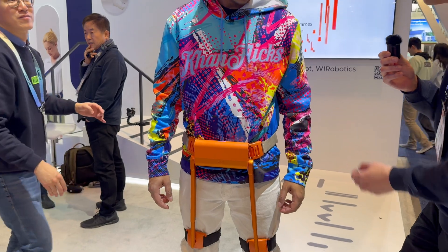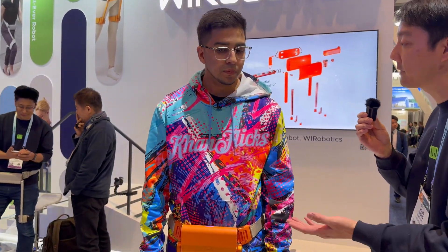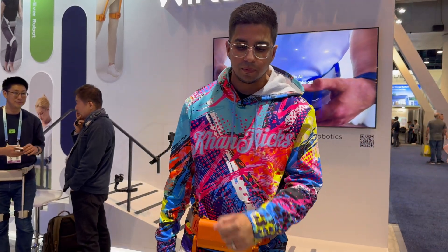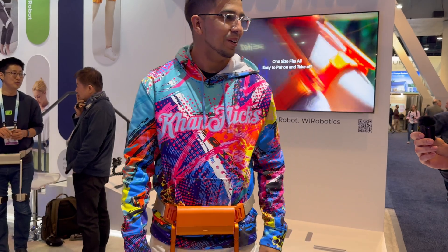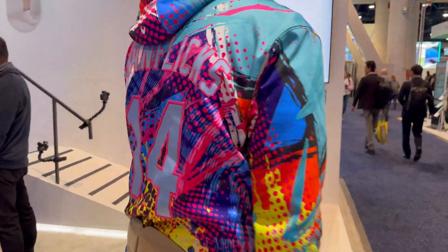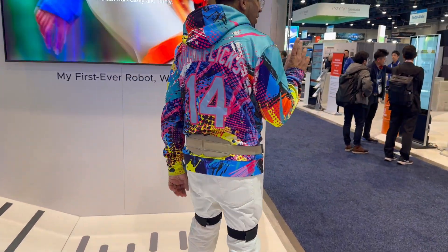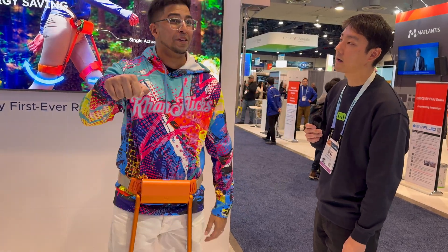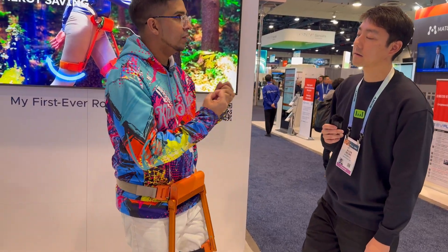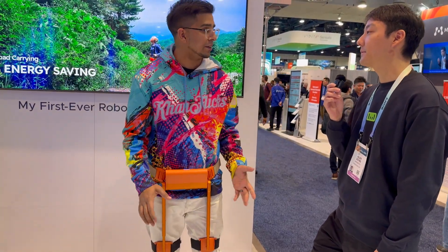Okay, so right now we're on assist mode, so as you walk you're gonna feel it kind of lifting you forward. I do see it, it's like that, a little bit. So you wanna take a walk with us? The other one I reviewed does this — when I do it, like that. This is actually very light and natural. It doesn't feel like it's forcing me. I like that.